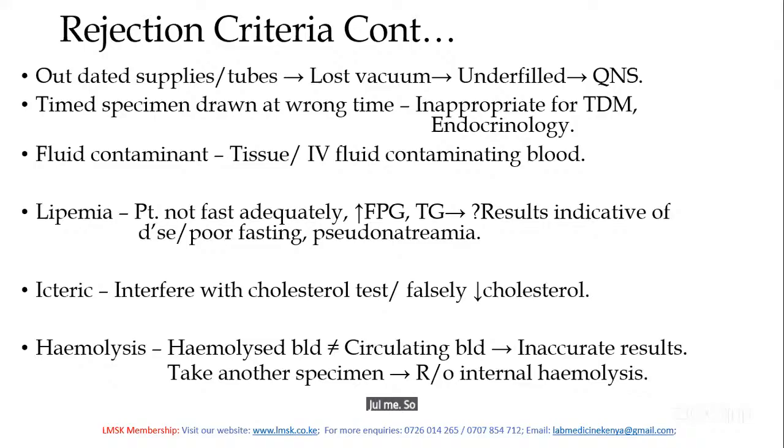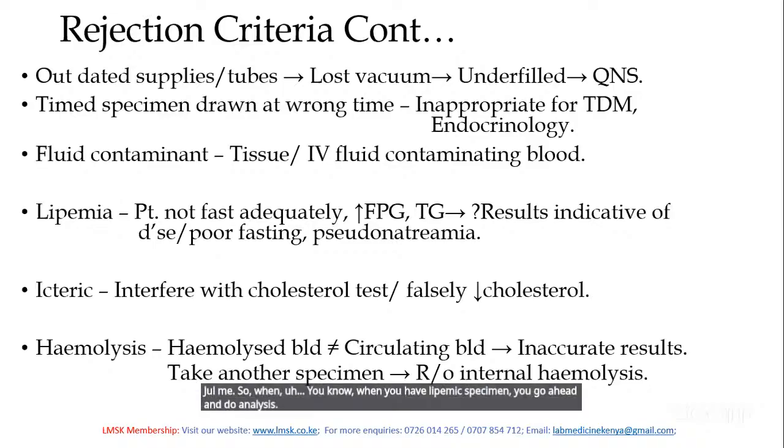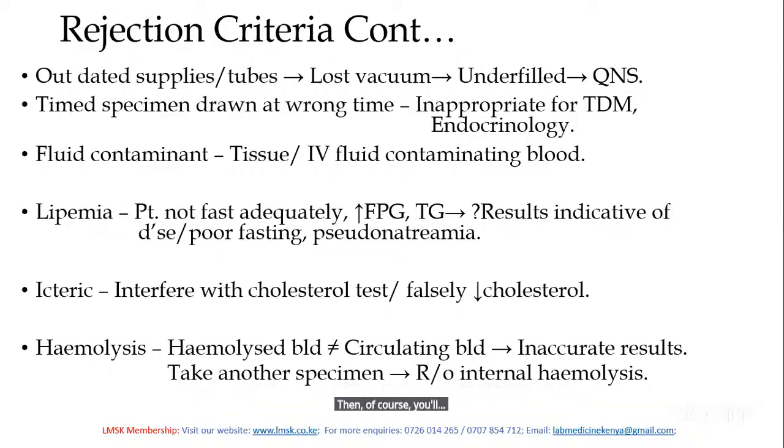So when you have a lipemic specimen and you go ahead and do analysis, of course you will discover that the fats are high, triglycerides are elevated. Now, the question will be, is that a true picture? Is it true that the triglycerides are elevated, so the patient has high triglycerides, high lipoprotein, or is it because the patient did not fast adequately as required?